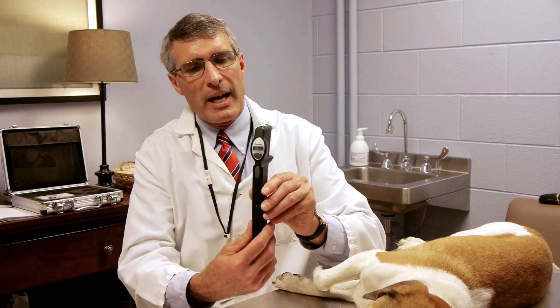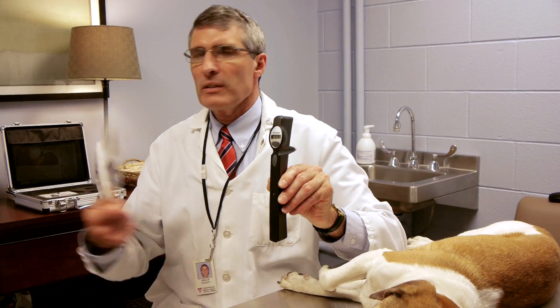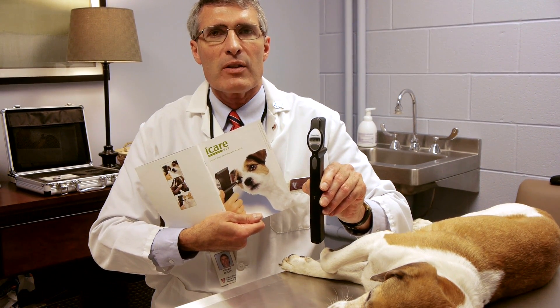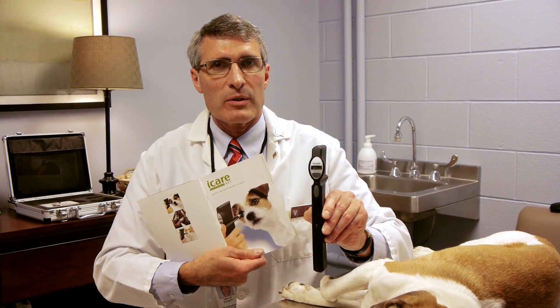This instrument has numerous buttons. The instruction manual is very, very useful as far as setting this up for either small animals — dog, cat — or using it in large animals, horse.